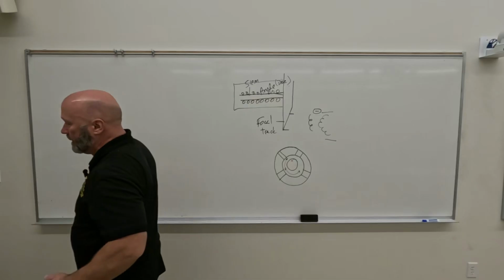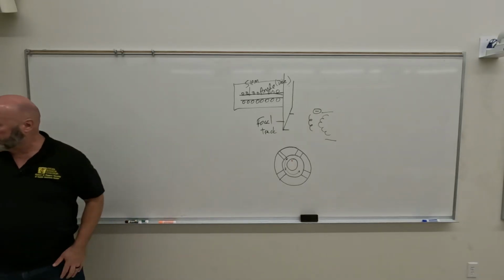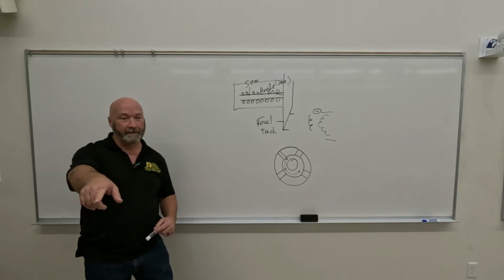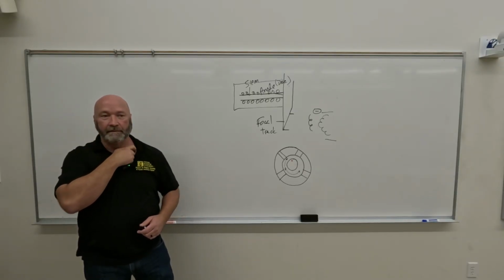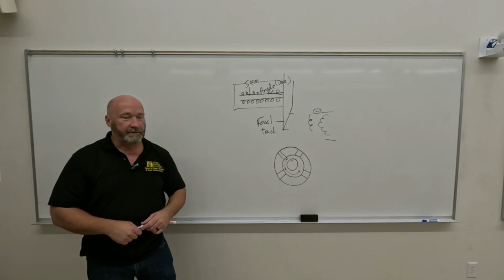Put the lid on. Okay, so the other reasons that Bushong mentions: high atomic number. What's the significance of high atomic number? Well, how did we start this semester? How do we create X-rays? Heat and electrons. Okay, we're going to get to heat in a minute. What are the two ways we create X-rays? Brems and characteristic, right? So electron interactions: brems and characteristic.